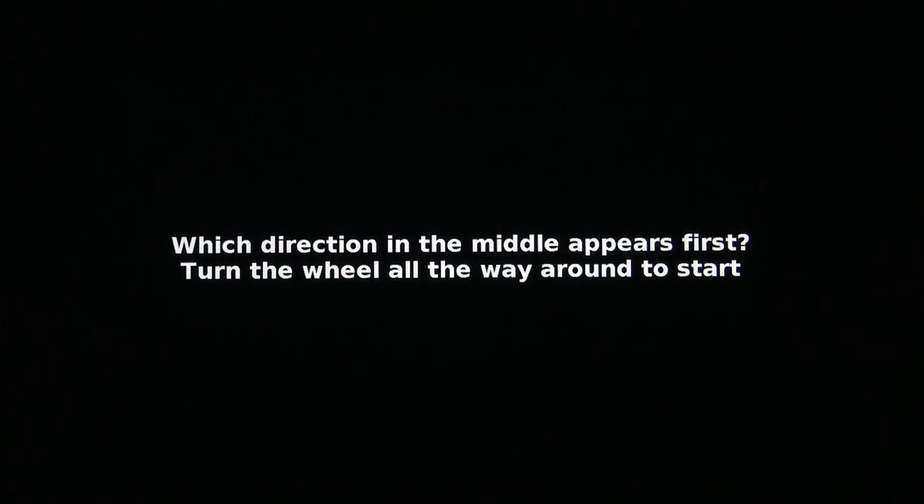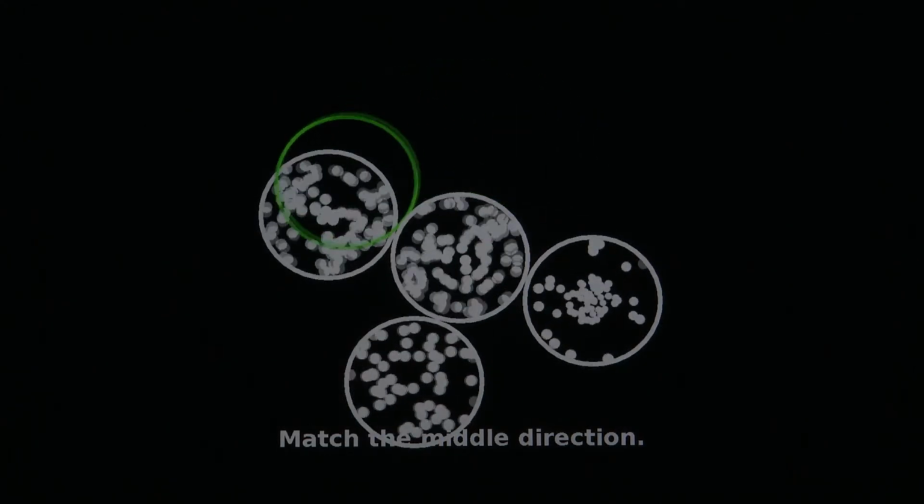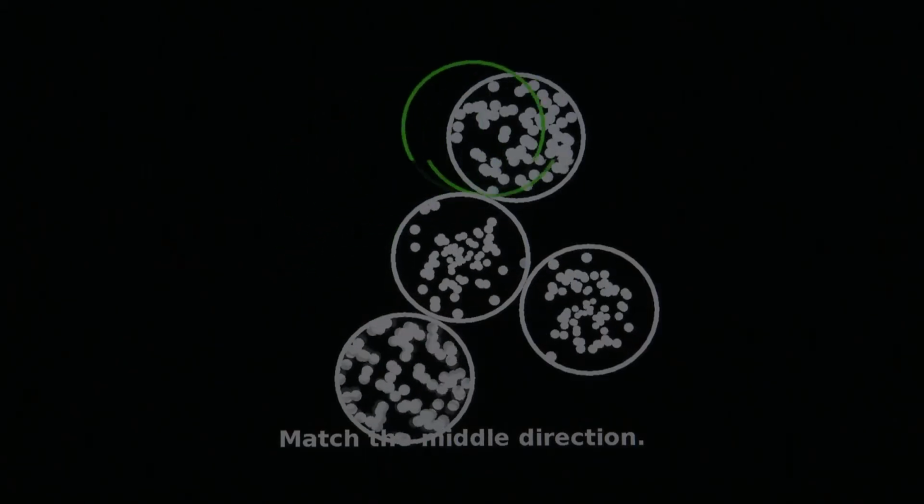The final part of our test is looking at your motion memory. Remember the first pattern shown in the center of the screen, and then move your wheel to find it in the choices. Keep doing this until the test is complete.